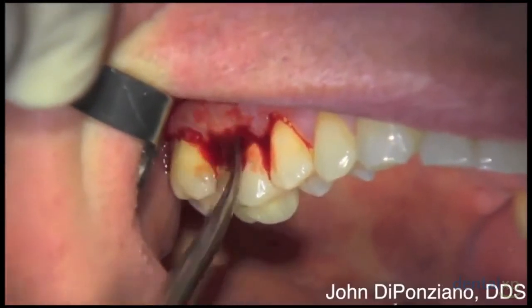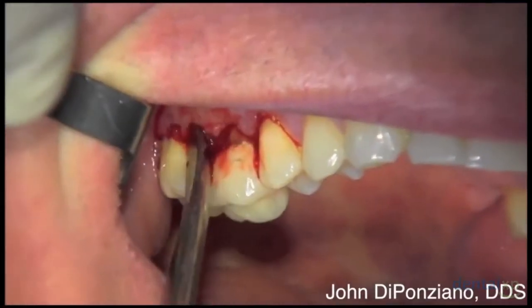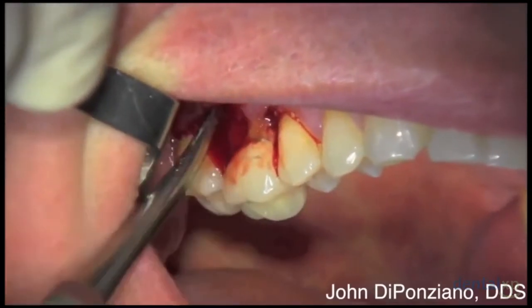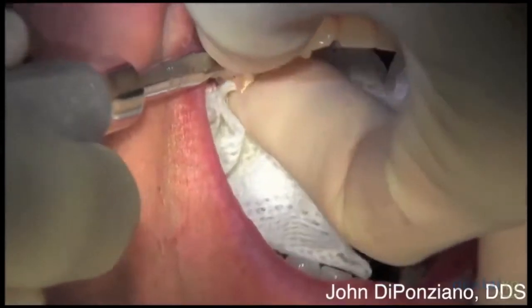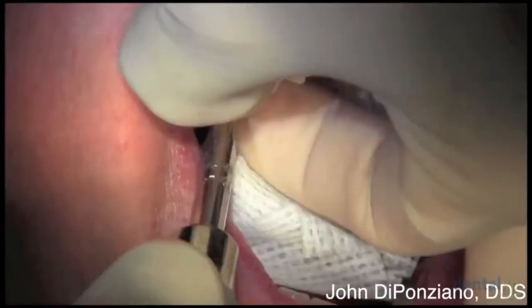A periosteo elevator is used to release the flap with the periosteum intact on the flap. Then a coarse diamond is used to cut through and remove the crown.